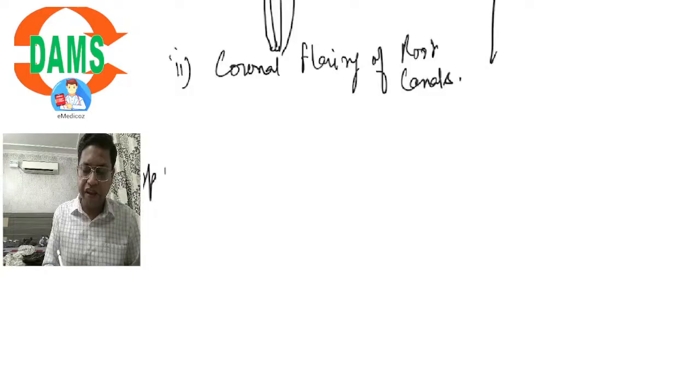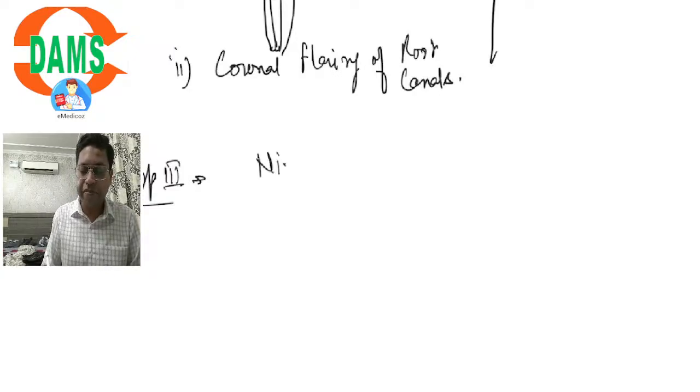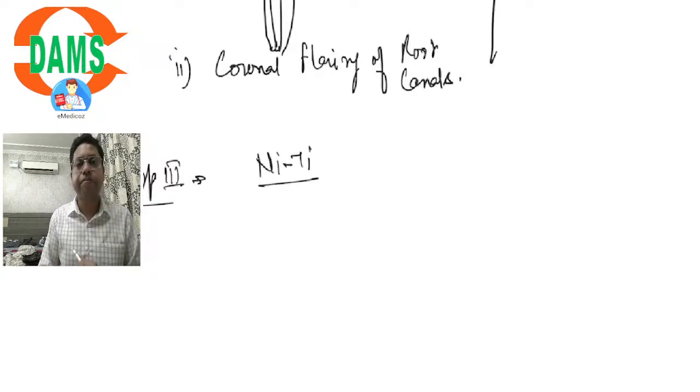Coming over to group 3, which are the major category of instruments used. They are the rotary nickel titanium instruments.